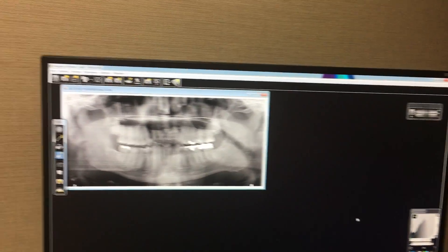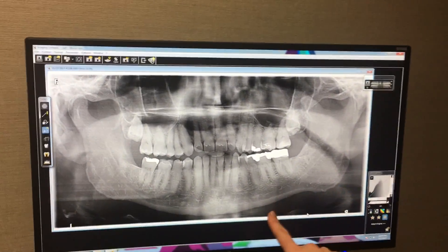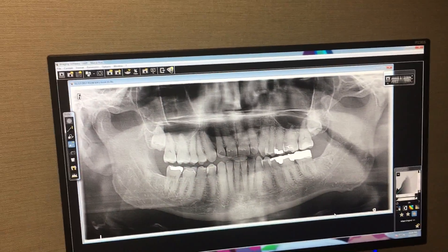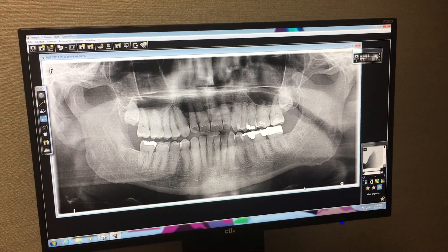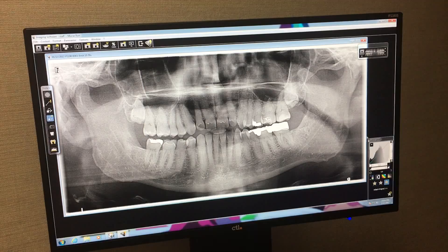So this is how simple it is. This x-ray is incredibly clear and we can see all the bony structures really well on him. He's got a couple wisdom teeth that we would never be able to take an x-ray of in the mouth, so we can see these completely — make sure there's no cysts growing around impacted wisdom teeth. And it's a beautiful pan.